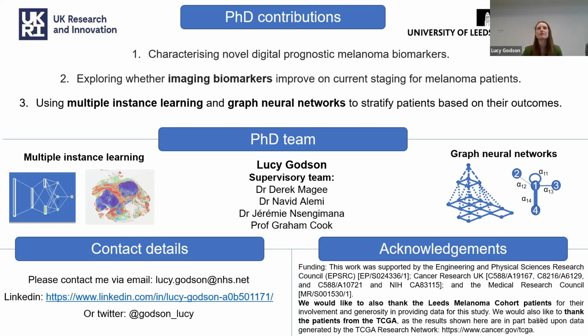So were there some cases that were not analysable due to very high pigmentation? So this is something that I didn't look into much because we didn't perform a lot of QC. It was something, though, when we looked at error cases, sometimes they did contain pigmentation. And yeah, it's a unique challenge to melanoma.